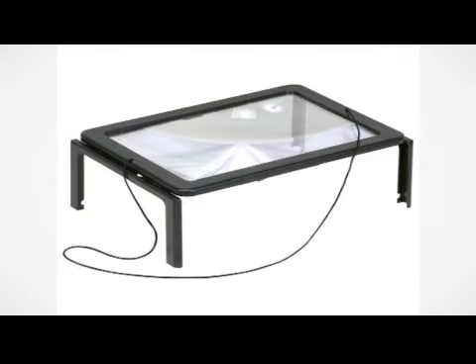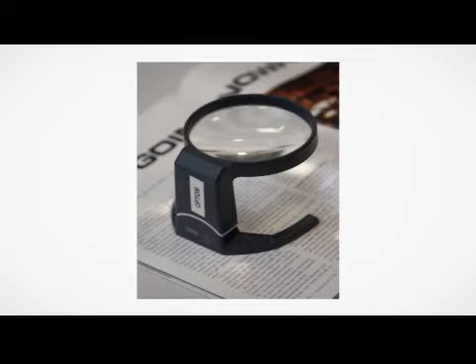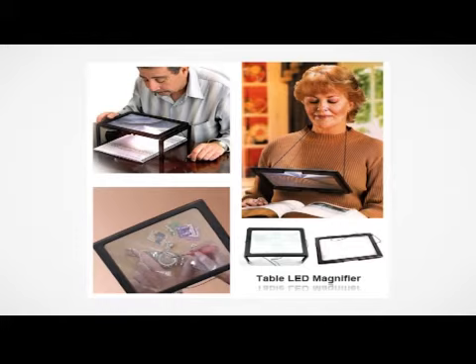Disadvantages: they have limited mobility, being inconvenient to carry around. They are awkward to use on non-flat surfaces. They require the use of a reading stand. They have a very limited field of view. They can cause excess shading and reduce the amount of light on the viewing surface unless self-illuminated. Most available designs make writing difficult if not impossible. Prolonged use of these devices may result in poor posture unless a reading stand is used.